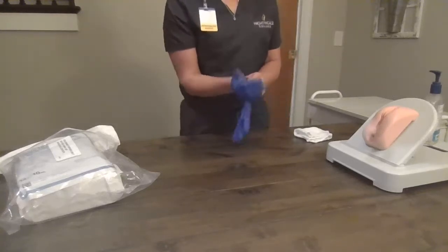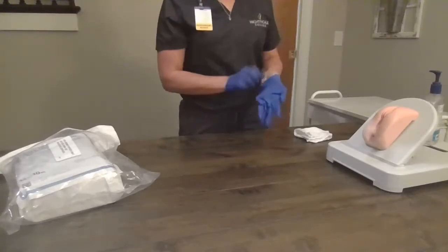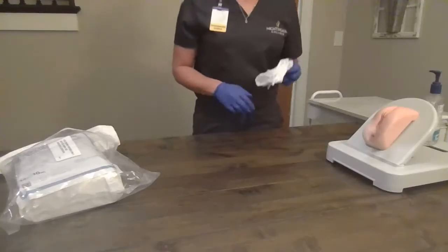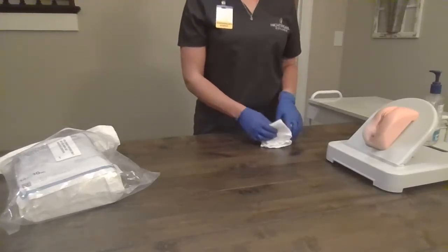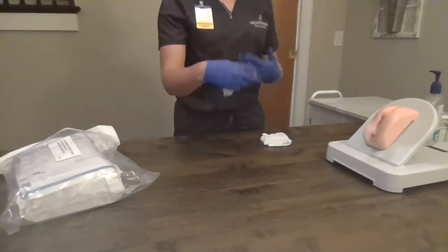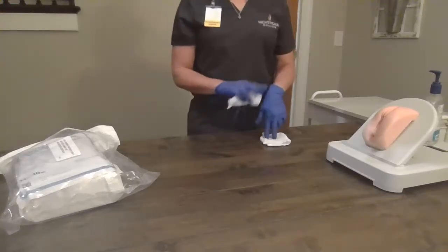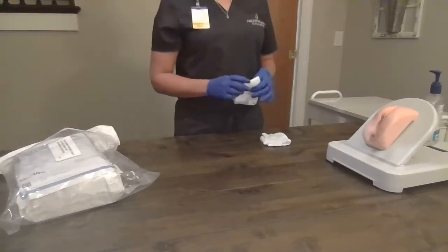Ms. Smith, first we're going to clean the area, and then I will walk you through the Foley. We'll apply our gloves. We have our washcloths with some no-rinse soap and water. I want you to bend your knees and then lay your knees open like a butterfly. We're going to bring your bed up to a good working height. I'm right-handed, so I am on the patient's right side.